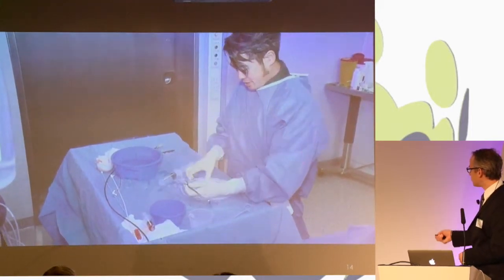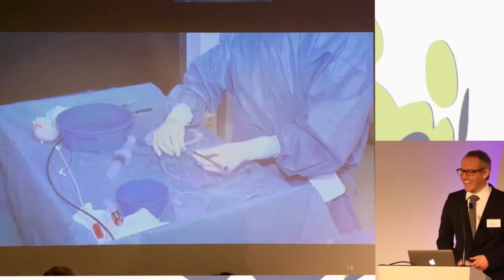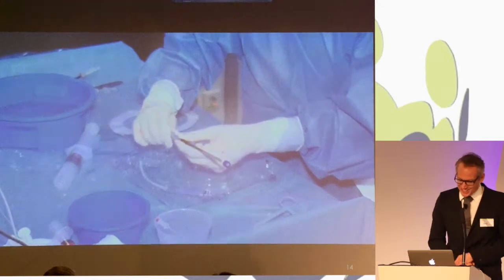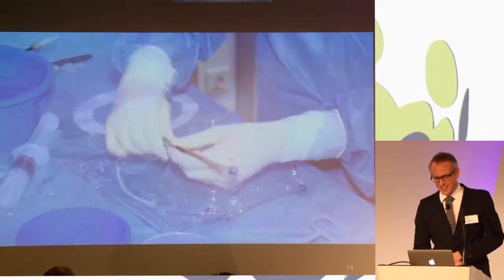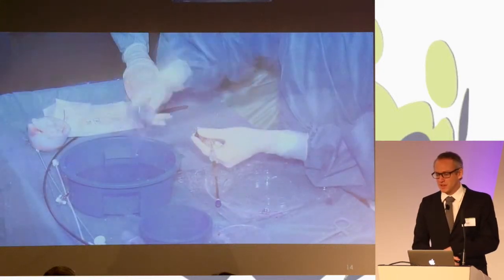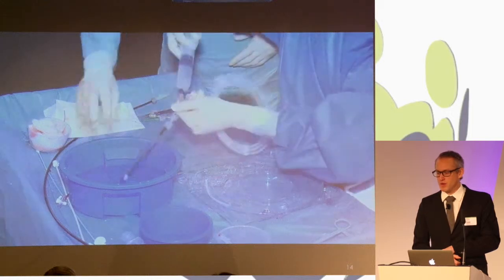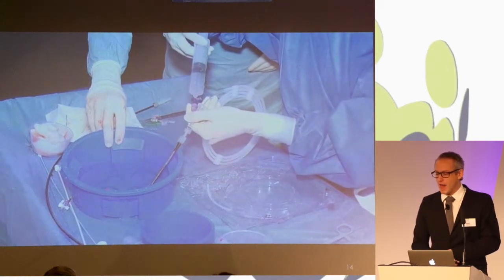That's why I let Dr. Chan do it. He can even prep this device. You just need to de-air it, best with a 50 cc syringe in my opinion, and spend some time on proper de-airing in the water bath.